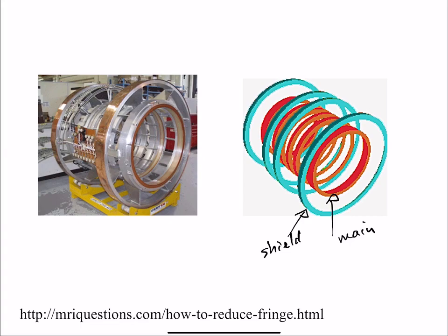Okay. The idea is, does anyone here know anyone with a pacemaker? Okay, so some of you know people with pacemakers. If they walk through a magnetic field, what happens? If you go back to freshman physics, what does a time-varying magnetic field give rise to?